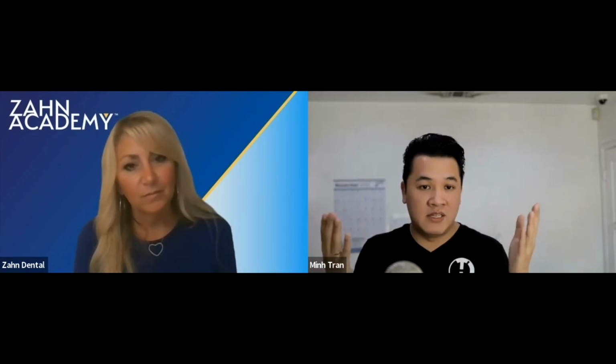So what does that do? You're able to bring it into software, calibrate both images, and do a virtual try-in. You see this very often, a cutout tooth pasted into the patient's mouth. But because the lighting conditions and the camera conditions were identical from the office to the lab, you no longer have to have that patient come to the lab for a shade match.